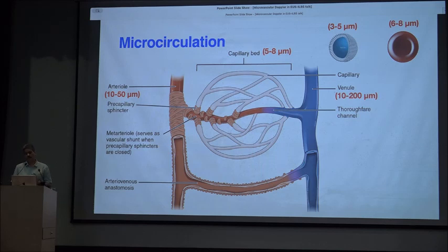So let's come to what I had to talk to begin with, the imaging of microcirculation with Doppler. So macrocirculation is by the conductance arteries like the aorta, then the resistance arteries, say the celiac or the SMA, and these will branch around 6 to 8 times once they enter any organ like a nutrient arteries, gradually decrease in size and become arterioles.